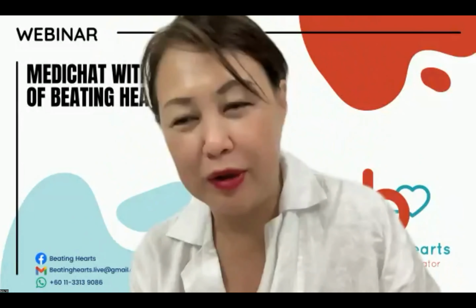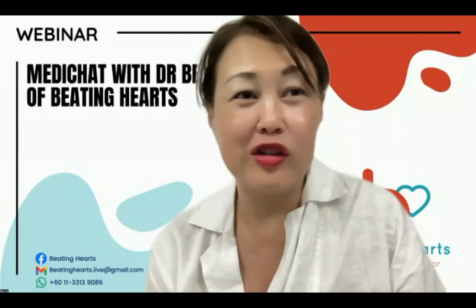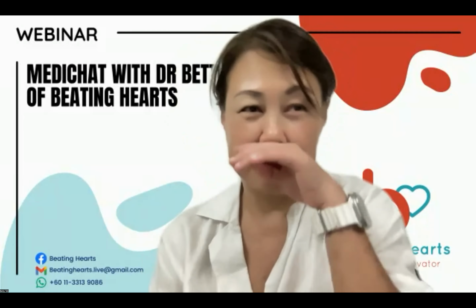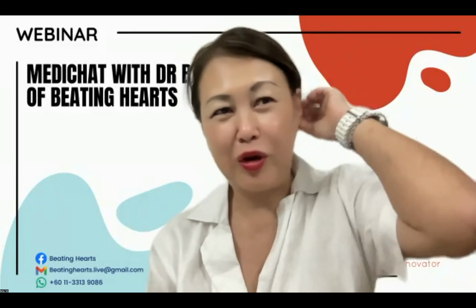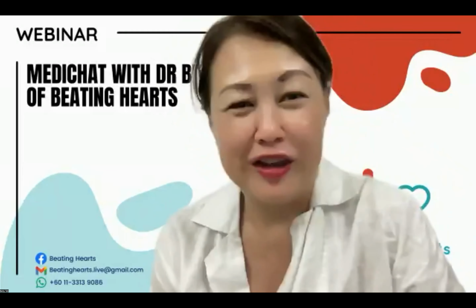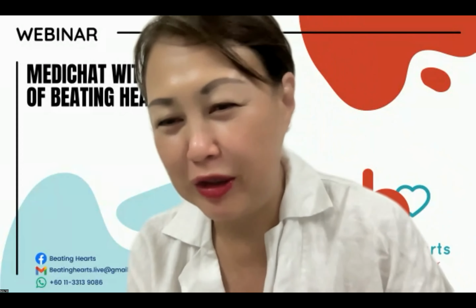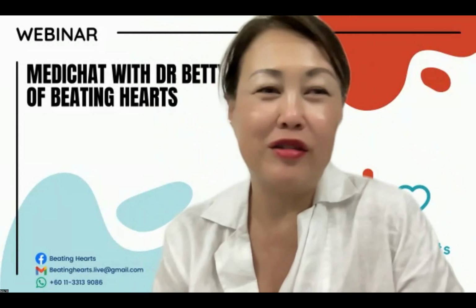Christina Saw said, actually, can echo be a non-invasive test for coronary artery blockages? Yes, you can do stress echo. It's non-invasive, it's objective. It's not something that I really enjoy doing, especially with CT angio being so readily available, I think stress echo is hardly used these days.